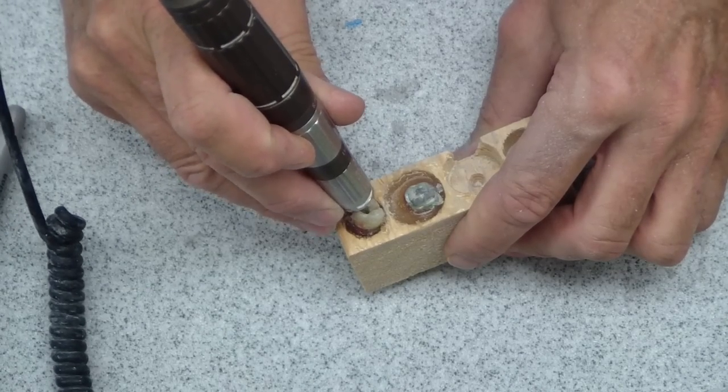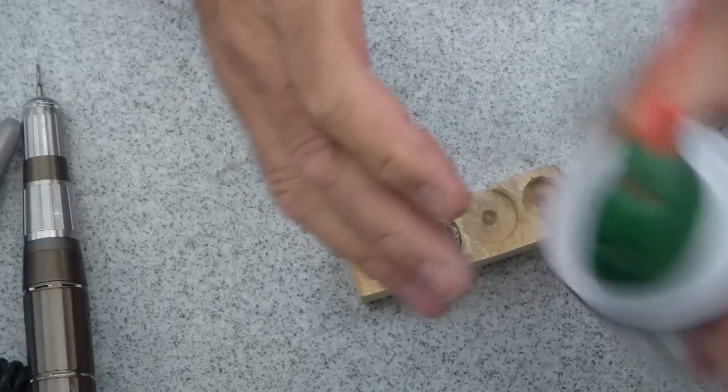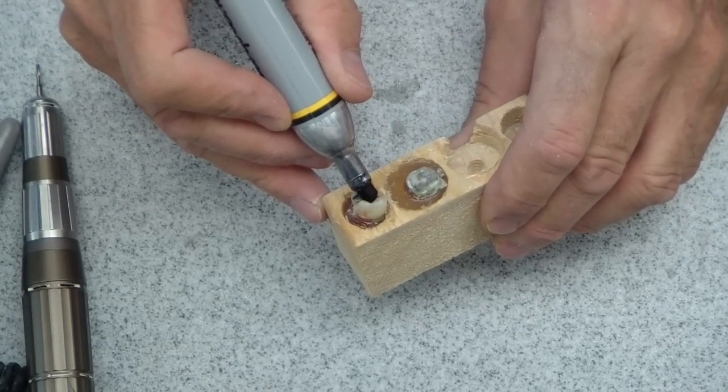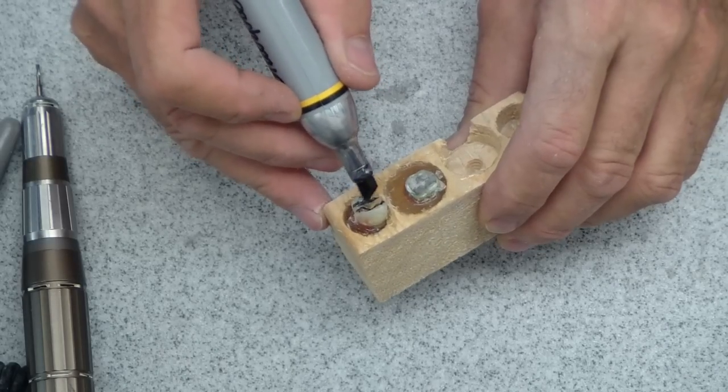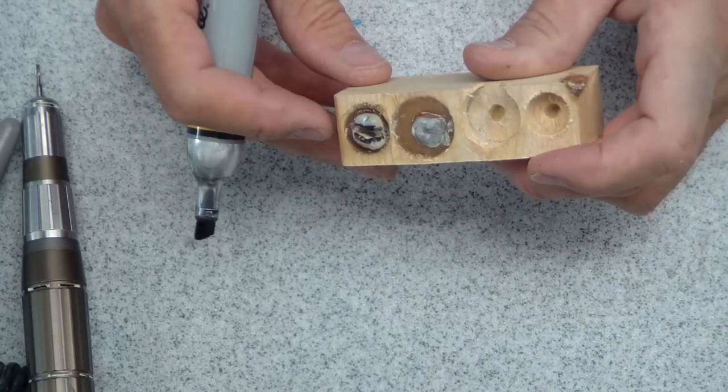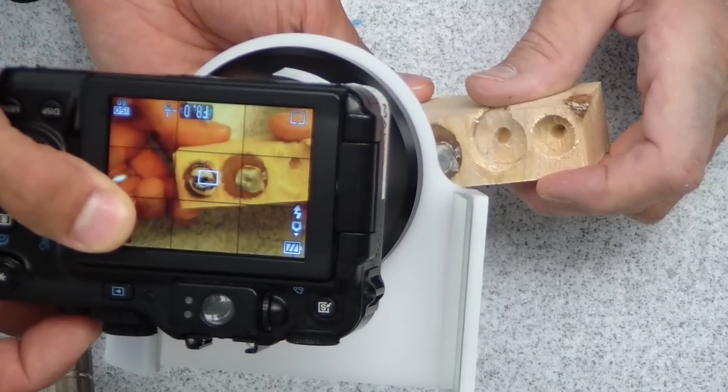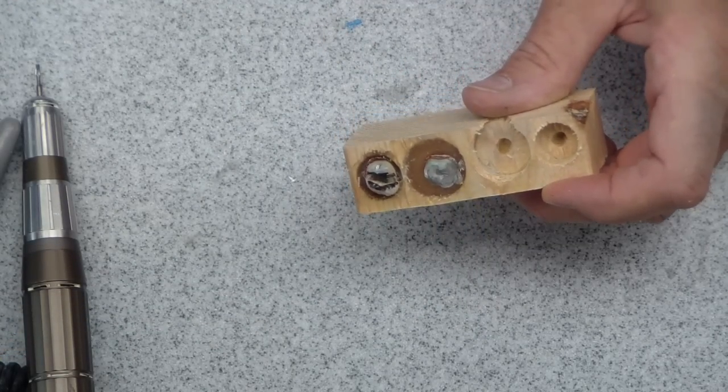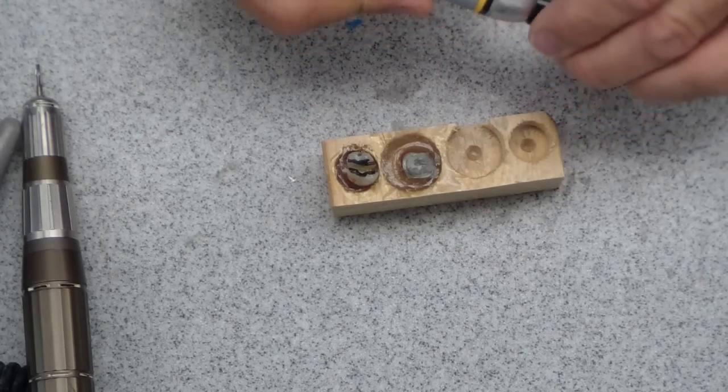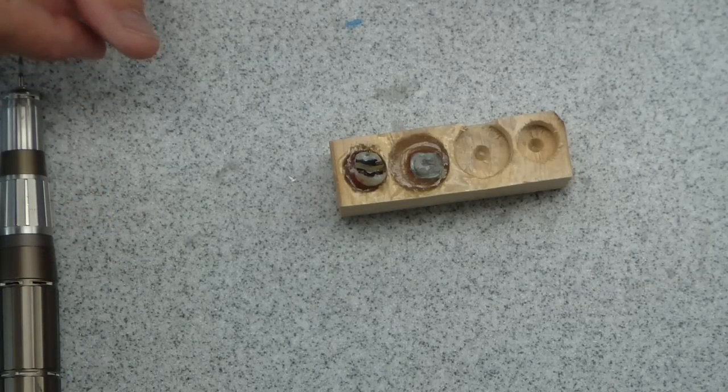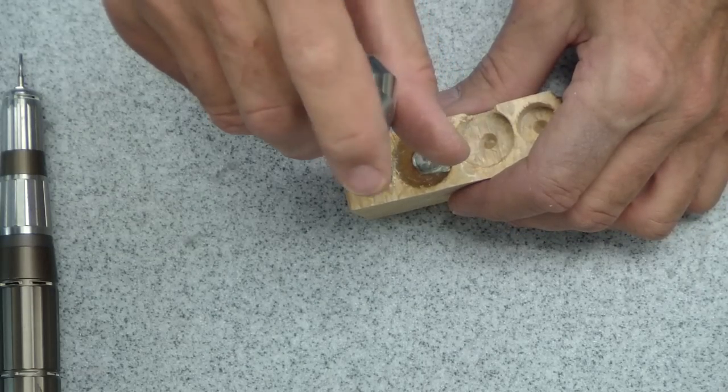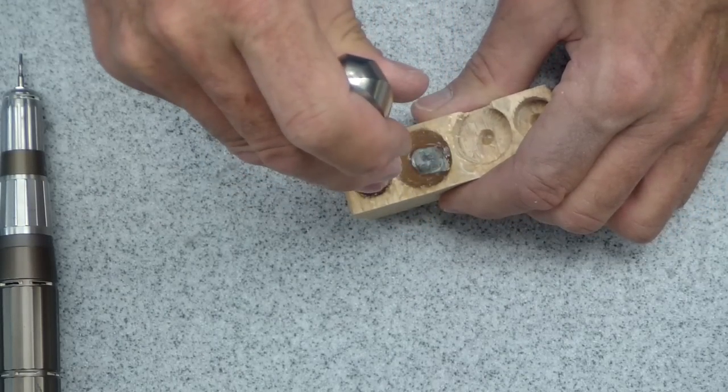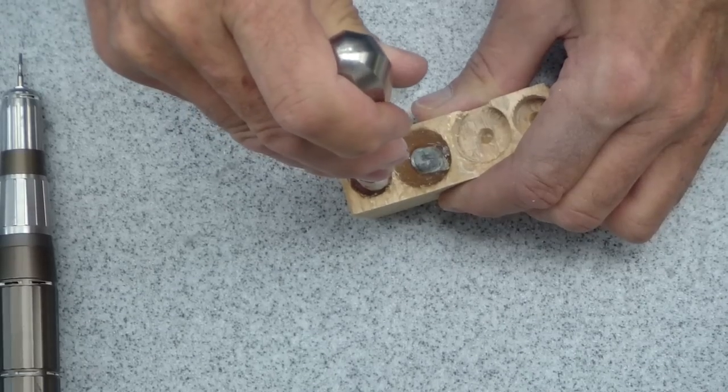I'm going to go a little further with these teeth because they are dry, desiccated teeth, and they tend to chip, so I'll probably do a little further cutting than I would clinically in the mouth. I'm going to mark this with a little magic marker here. Hopefully you can kind of see the outline here a little bit better. You can see it's kind of a semi-lunar cut on there. And now I'm going to continue by separating the two halves of the tooth.